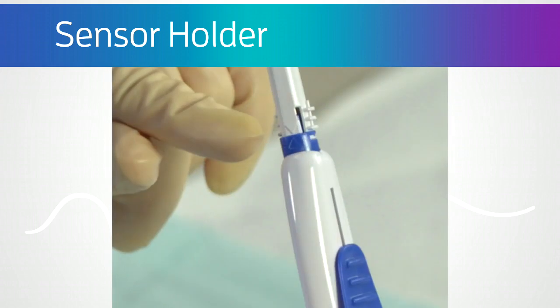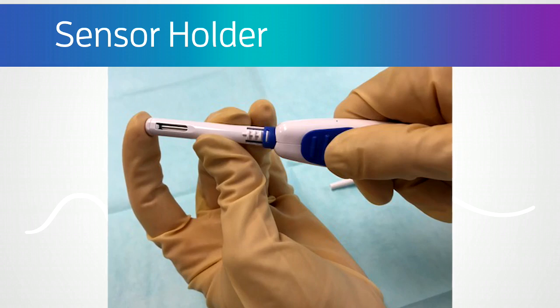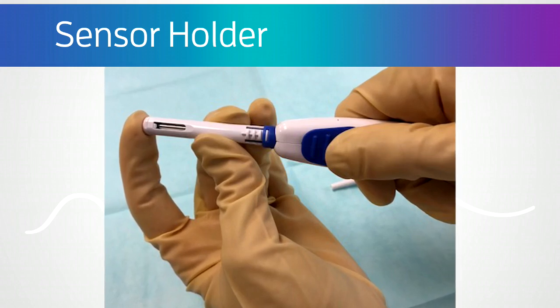In the correct alignment, the small white triangle at the bottom edge of the sensor holder will be pointing to the small blue triangle below the cannula on the insertion tool. Now depress the blue slide down to unlock it. Support the tip of the sensor holder as you advance it all the way forward until it stops. This loads the sensor into the cannula.